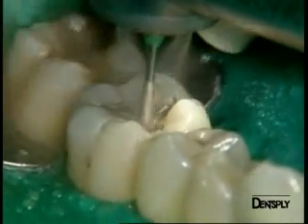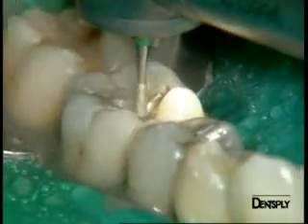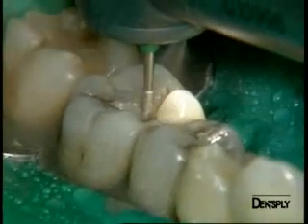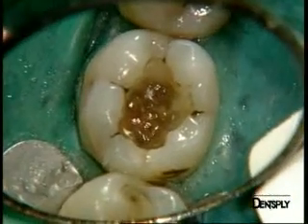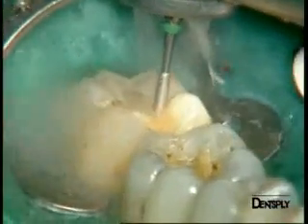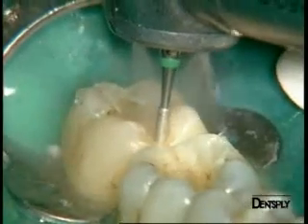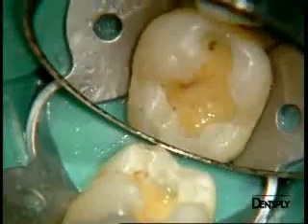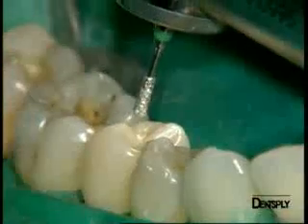The first stage consists of removing the old amalgam. We proceed in small steps, using a lot of spray to avoid any overheating. Here you can see the amalgam is removed. In the same way, we remove the composite filling from tooth 7, taking care not to remove any healthy dental tissue. Here we have an occlusal view after the composite was removed.